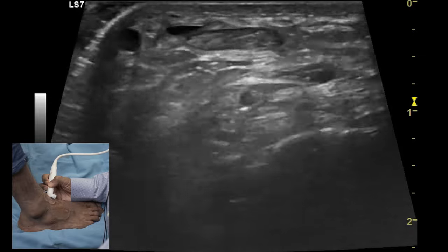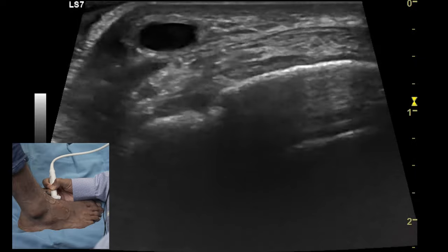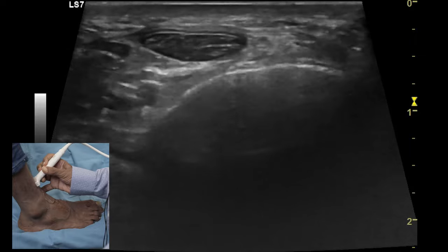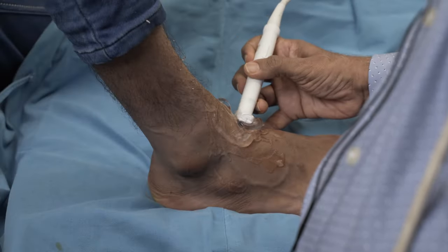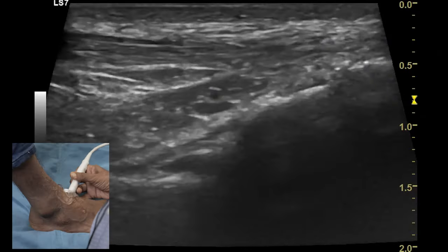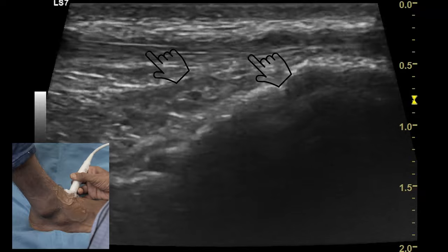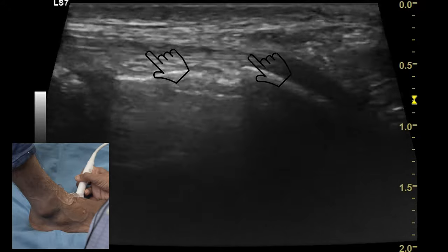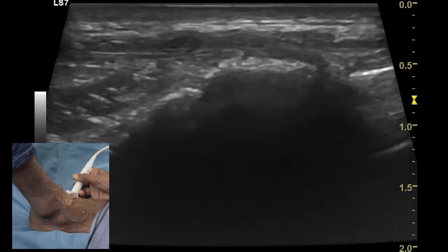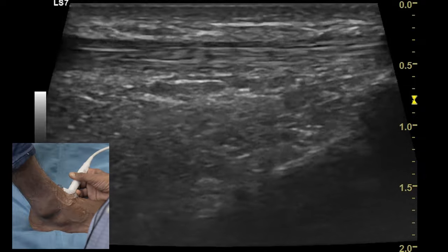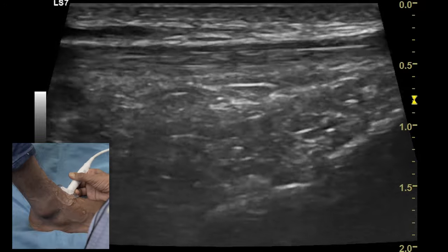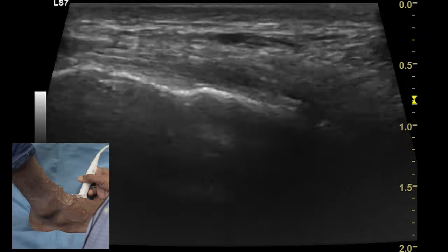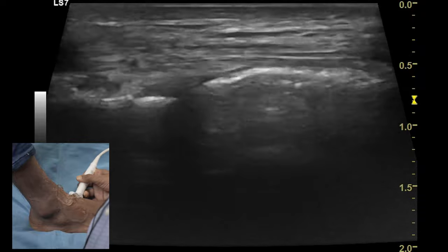This tendon can be evaluated all the way distally to its attachment to the medial cuneiform and proximally to the level of the musculotendinous junction. Once the transverse examination of the tibialis anterior is complete, we need to turn the transducer 90 degrees and visualize this tendon along the longitudinal axis till its insertion over the medial cuneiform bone. Like any other tendon, this tendon has a typical fibrillary appearance due to bright echoes from the collagen fibers and dark echoes from the intervening connective tissue.